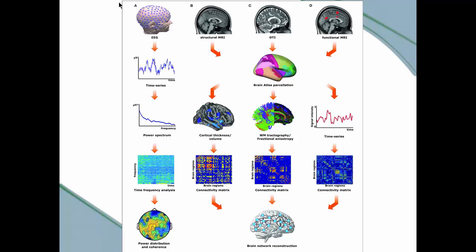But at this point, we're going to use your Muse headband, which measures two very important points of your brain: your medial frontal lobe activity and your medial temporal lobe activity, in reference to a ground. So we're measuring left, right, frontal, left, right, temporal, and then those are all referenced to a single ground point.